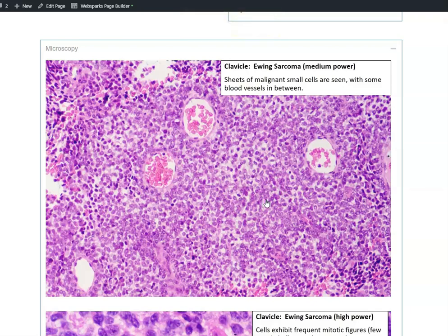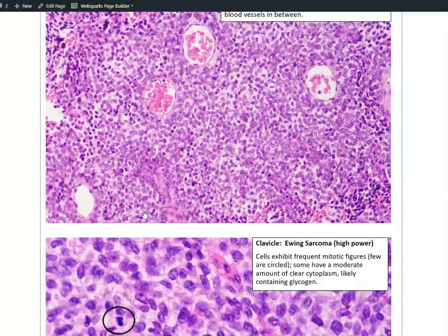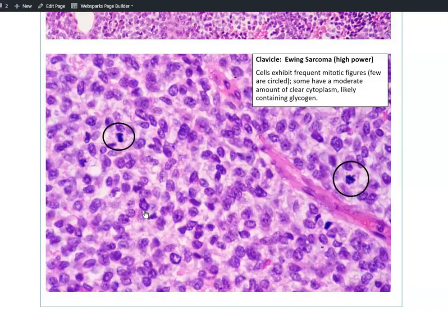These are tumors that are composed of rather small cells with very high nuclear cytoplasmic (NC) ratios. Usually they are immature tumors — they occur in children and have a very high proliferative rate.